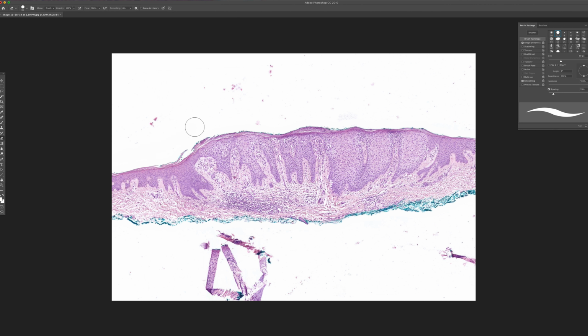I'm just going to follow this all the way along, and as you can see, it's fairly easy to do. You just scrub along, overlapping the layer that you did earlier, and hey presto, you're beginning to see a nicely cleaned up specimen.